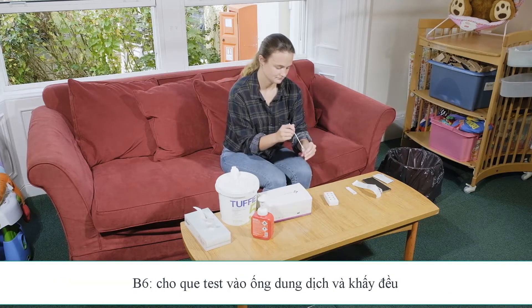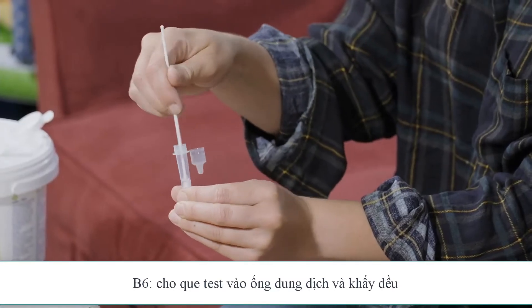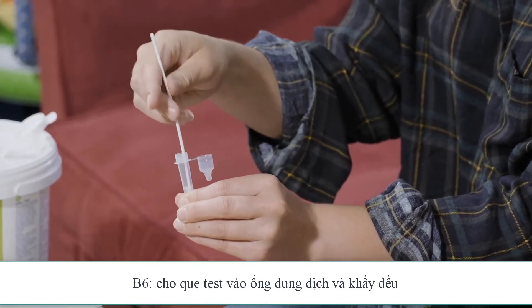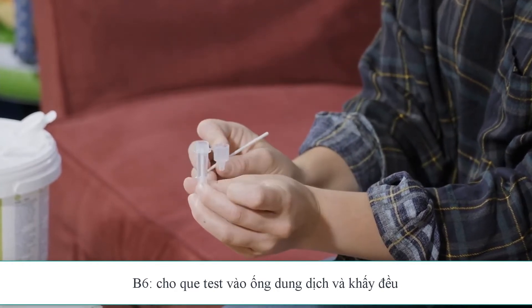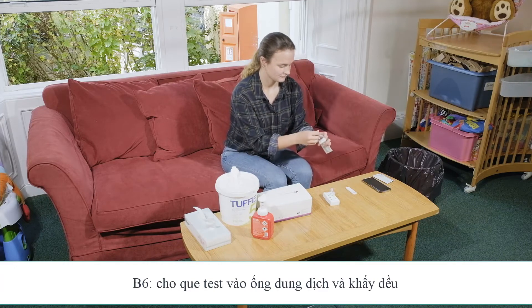Once you've completed this, put the swab into the extraction tube and rotate it in the fluid for 10 seconds, while squeezing the base of the tube gently. Lift the swab slightly, then break at the brake point. Leave the swab head in the extraction tube and dispose of the handle.